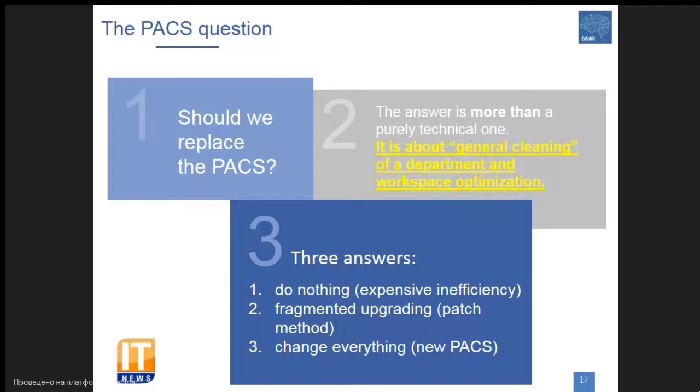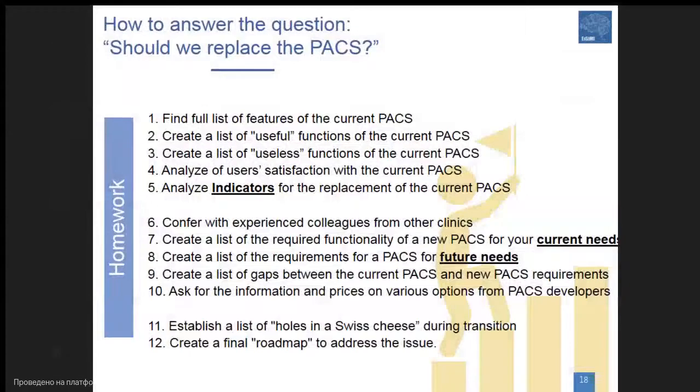When you ask the question, should we replace the PACS, you have three answers. Do nothing, and the inefficiency can be even more expensive. There might be fragmented upgrading with the patch method, or you can change everything with a new PACS. In order to come to the solution, there's a certain amount of homework that should be done.